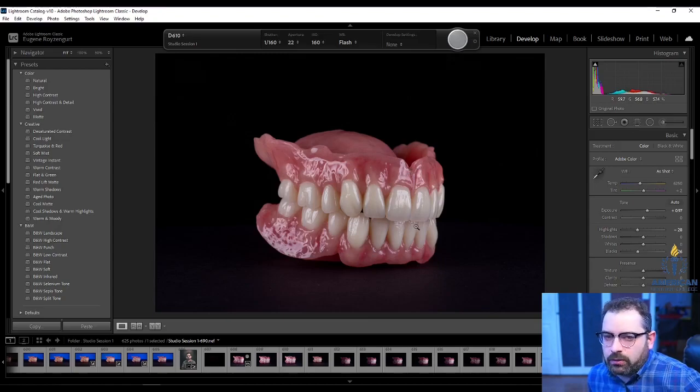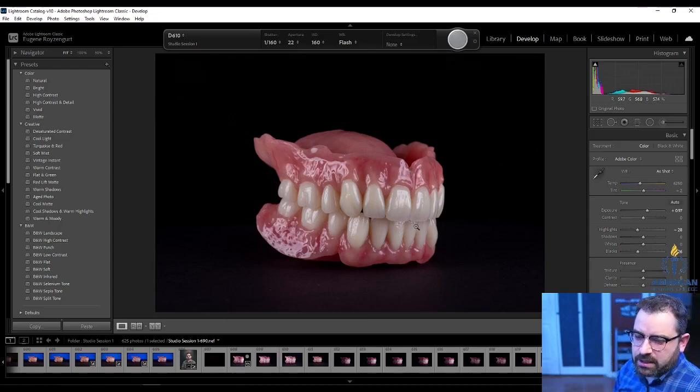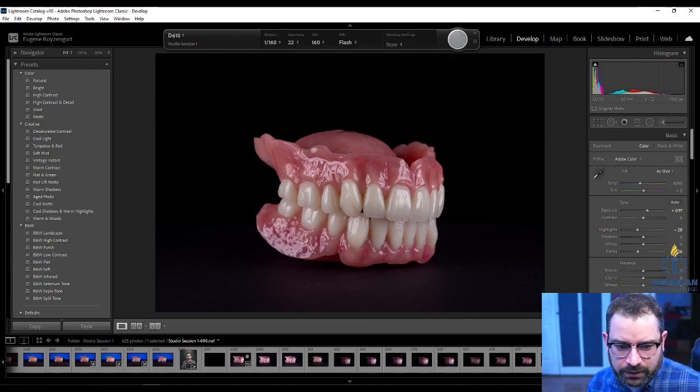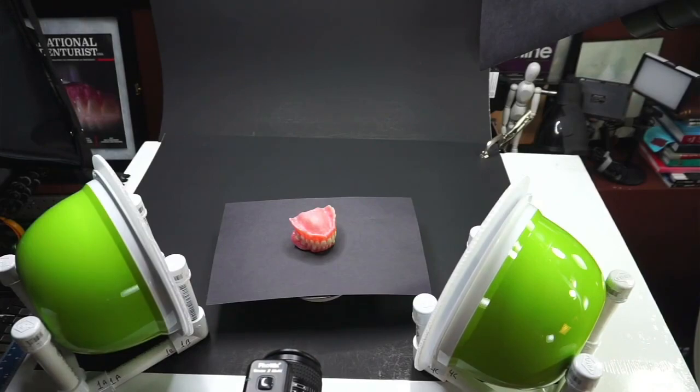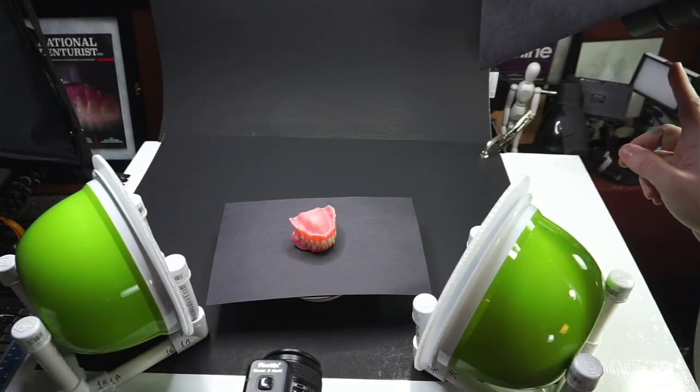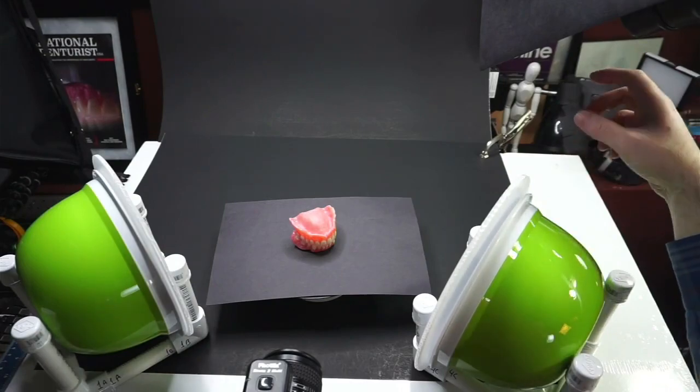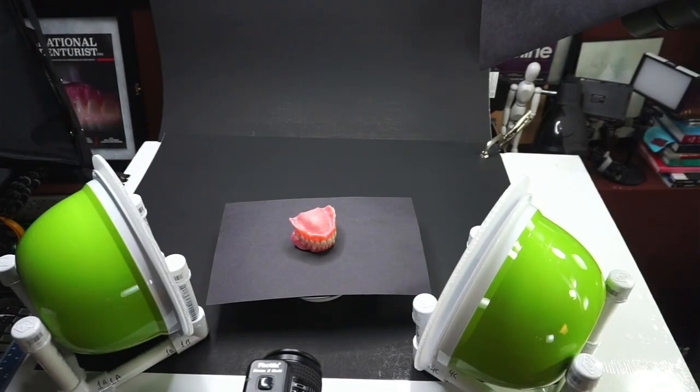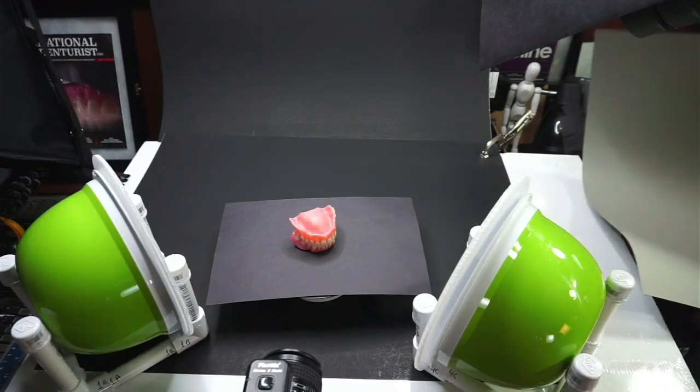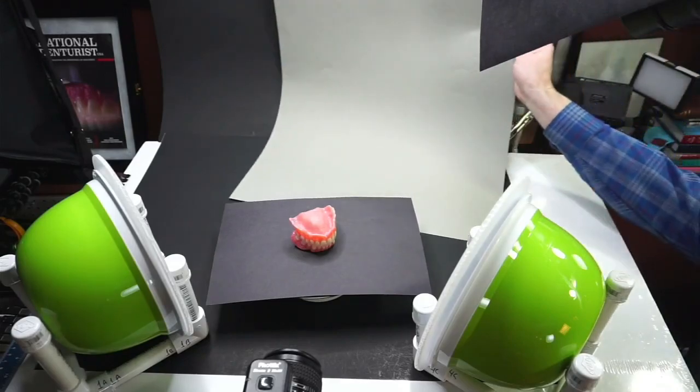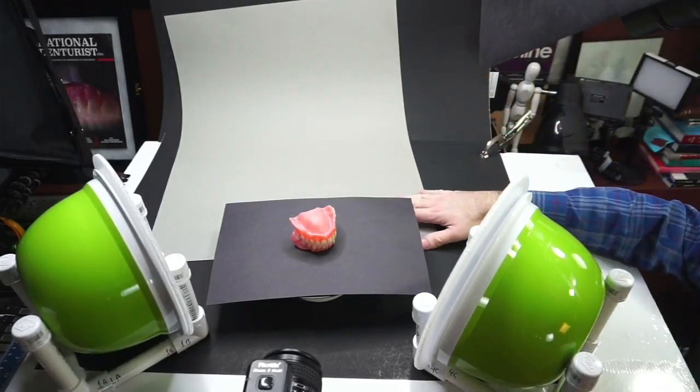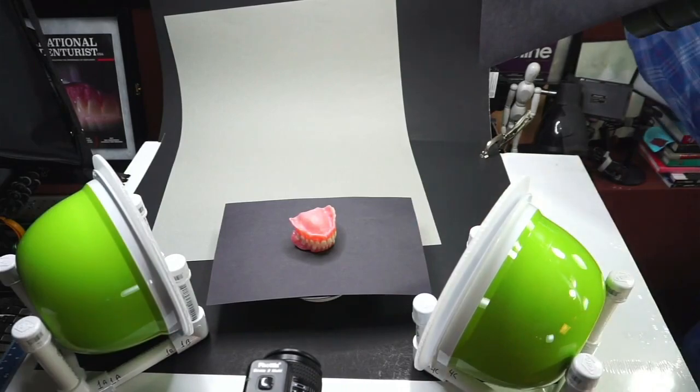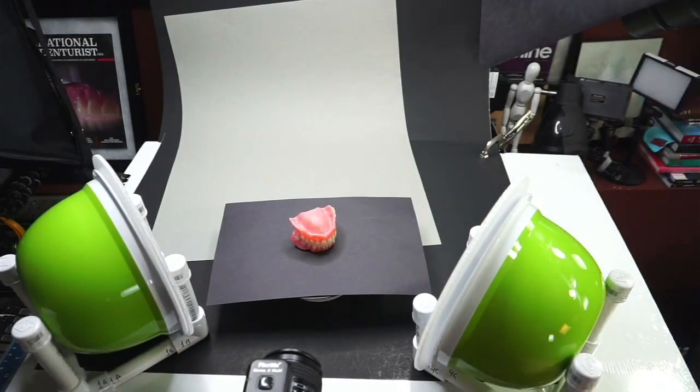But oftentimes what I also will do with my setup is actually use a colorized background. What you guys don't see is I have a strobe right on top of my desk right here. It's got a snoot on it and it's got a color gel. It doesn't reflect very well on a black background and it reflects a bit too much on a white background. But if I put a gray background back there, it will work actually pretty good. And let me show you what happens.